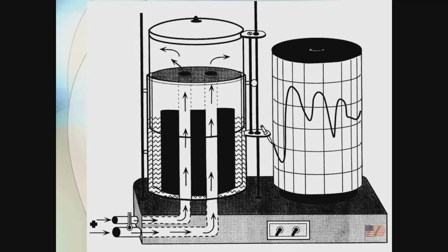But as the patient exhales, they end up filling the inside of this chamber. So when it pushes the drum upwards, that moves the pen. This is the kymograph. And this is spinning around, and as it spins, when the patient exhales, it measures the volume directly. That actually is the gold standard that is there.